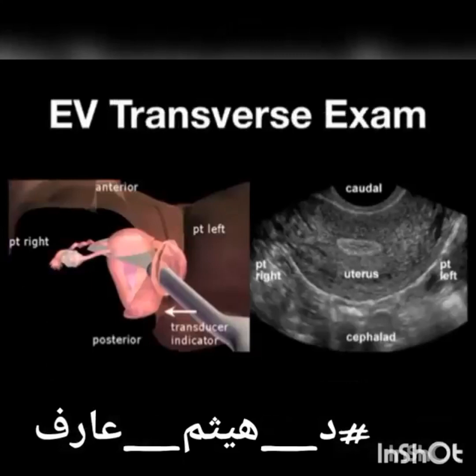The endovaginal transverse or coronal exam is going to be performed by taking the transducer indicator and going from the 12 o'clock position where your thumb would be pointed up at the ceiling to the 9 o'clock position where you have the indicator directed towards the patient's right thigh. And that's going to provide you with the following image. The transducer's in the vaginal canal, so this is caudal.